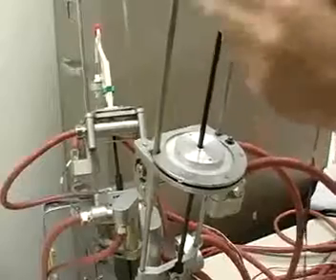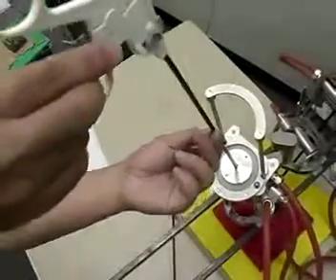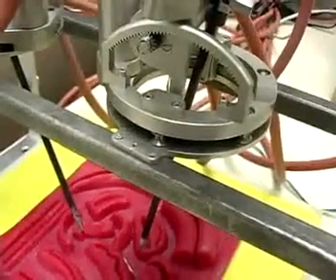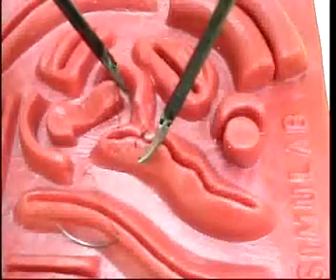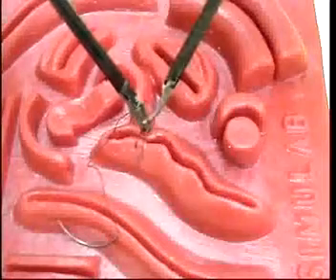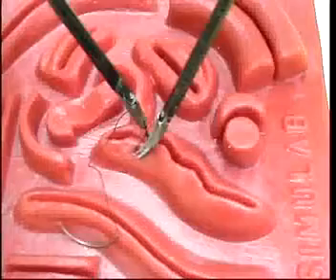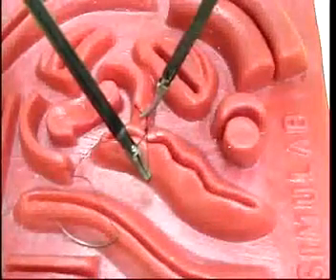Quick release clamps on the manipulators enable the surgeon to easily change instruments during procedures or to switch between manual and tele-operated surgical setups. Instruments with articulated wrists may be added to provide more dexterity in difficult tasks such as suturing and are currently in development. We are currently conducting user trials on basic manipulation tasks to quantify and improve the performance of the tele-operated system.